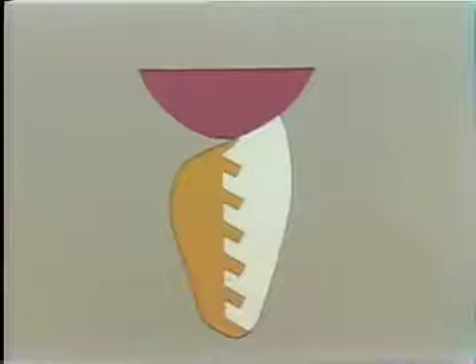flat, and then with suitable carbide drills, drill in these holes to a depth of a couple of millimeters or so. When the backing is waxed up, nylon pins are placed into here, and when the backing is invested and cast, of course, it comes out with what I'll call reverse pins going into the porcelain. The facing is then cemented into position on here in the normal manner.